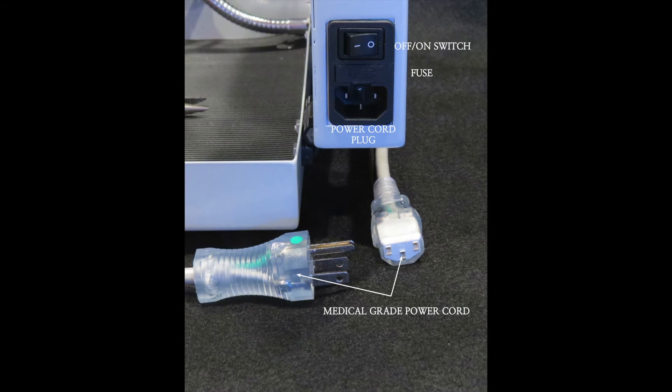Power Input: The power supply to the backlight is located on the side of the upper case. The hospital grade power cord plug connects to the fused off-on switch receptacle.